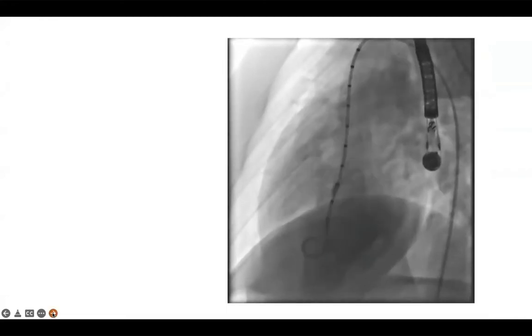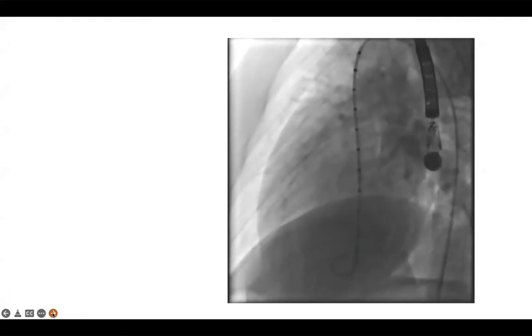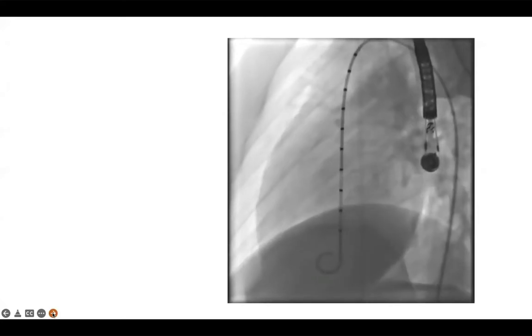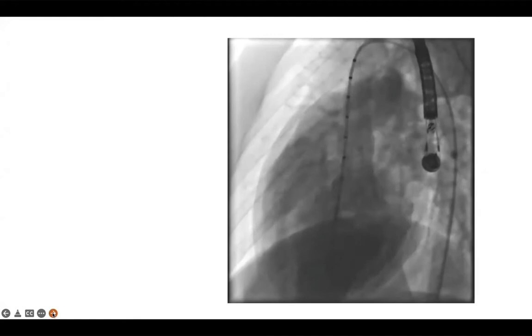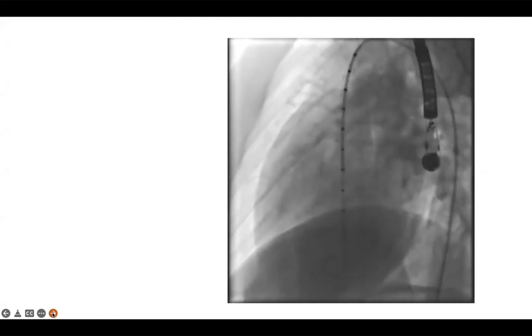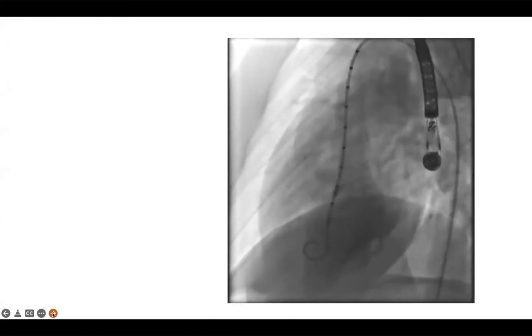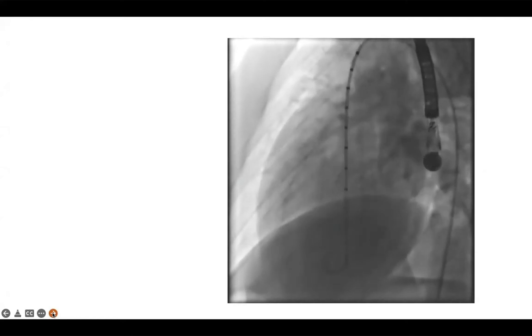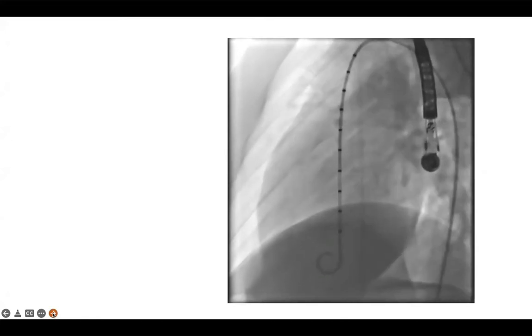And so the left ventriculogram, it's always difficult to know during these cases how useful it is. Again, it might provide a baseline for comparing the shunting before and after, but it's difficult to get accurate measurements of the defect in many instances, no matter what angle you use. Here you can see it's certainly a decent VSD and a decent shunt.